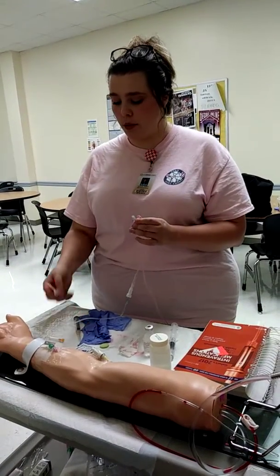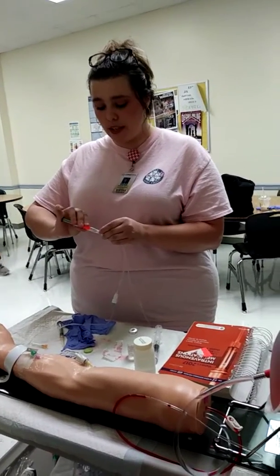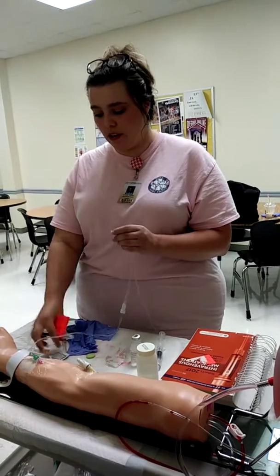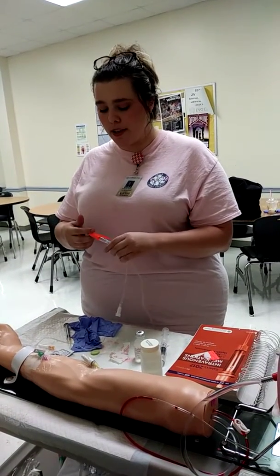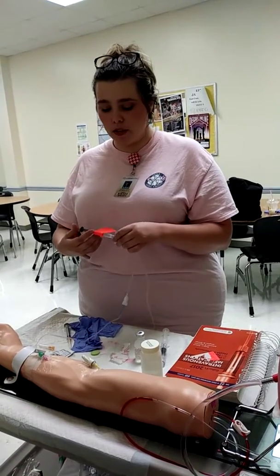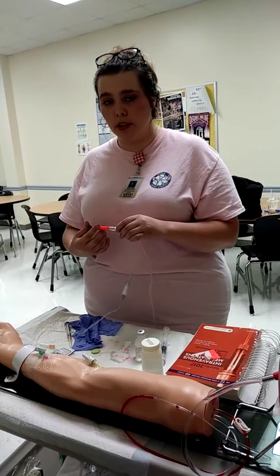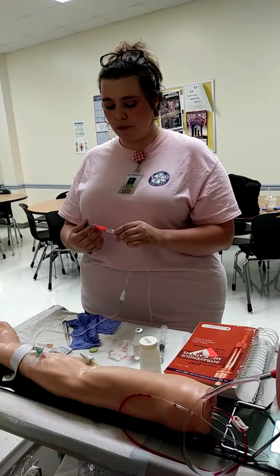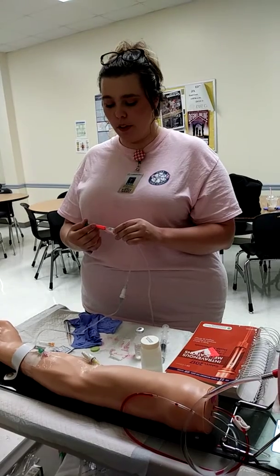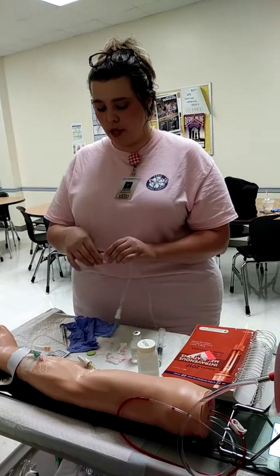And I'm going to go ahead and, once it's cleaned, I'm going to connect it. Furosemide is to be pushed over 2 minutes. So what I'm going to do is 1 mil per minute, or a half a mil every 30 seconds. So I'm going to push, and then I'm going to stop. Then I'm going to push some more, and then stop. And then I'll push some more, and I'll stop, over the remainder of the 2 minutes.